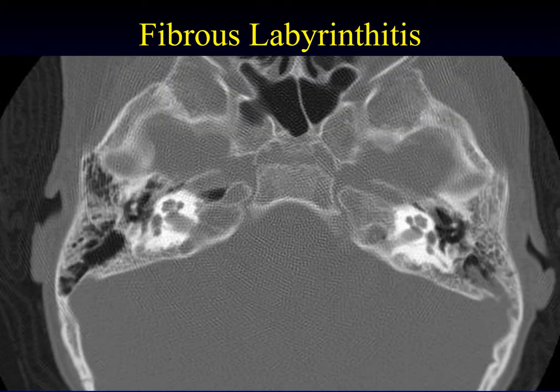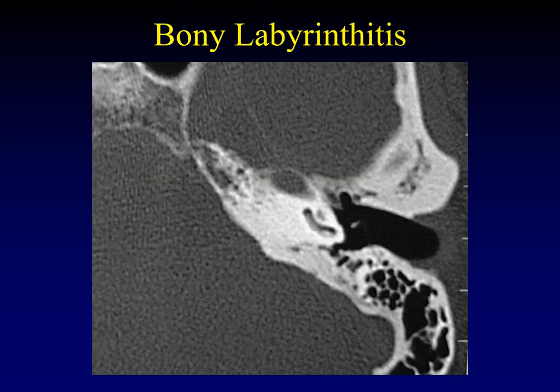Here's the fibrous stage on CT — it looks totally normal. You can't see the fibrous stage on CT. Once you get to the bony stage, CT comes to the fore. Instead of a nice banana or gherkin shape of the basal turn of the cochlea, here you can see only the anterior half is still patent. The posterior half is starting to fill in with bony material — abnormal calcium filling that in — and this is a progressive disease that will eventually fill it all in.